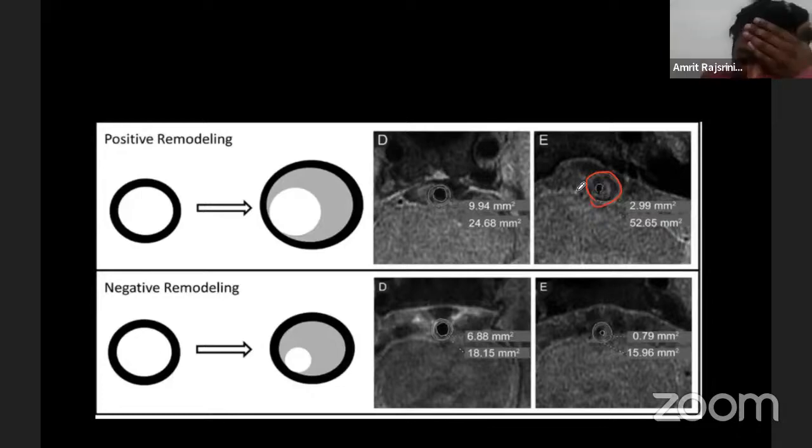So the media thins out, but the intima is thickened. So the wall thickness is still maintained in Moyamoya disease. And of course, there won't be any enhancement. There can be minimal enhancement sometimes, grade 1 enhancement. Similarly, in RCVS, there can sometimes be grade 1 enhancement. Okay, sir.